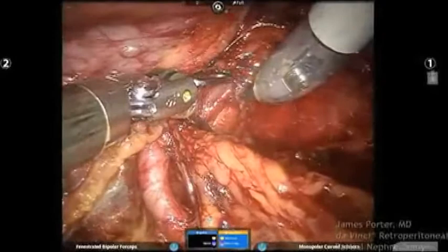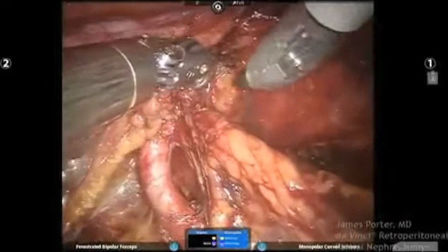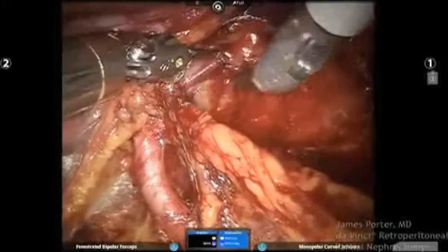Yeah, and there's that snowball effect that we've all been in where it is bleeding considerably, either venous or arterial, then your margin status is in question and the whole operation gets a lot more hairy.